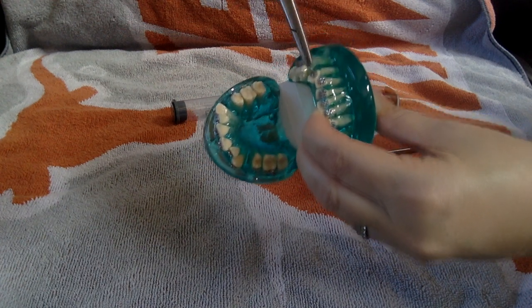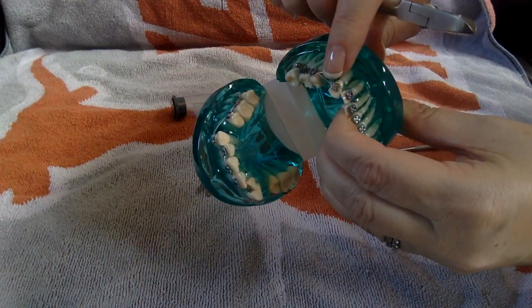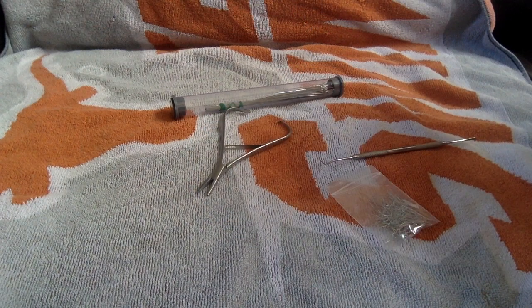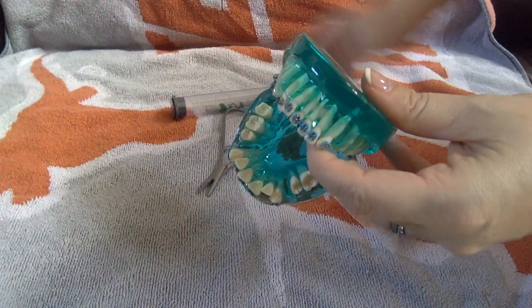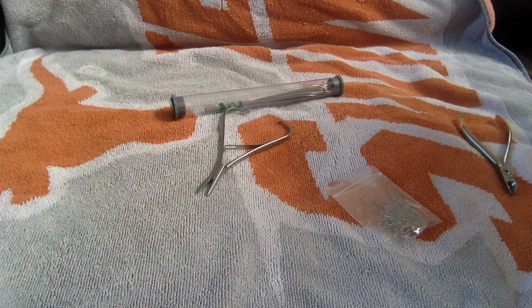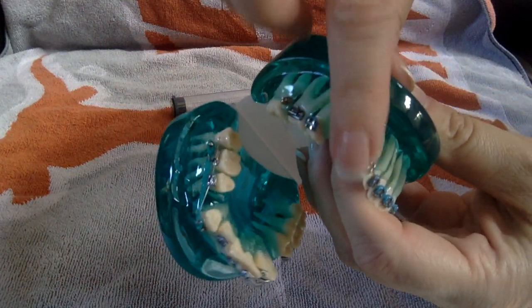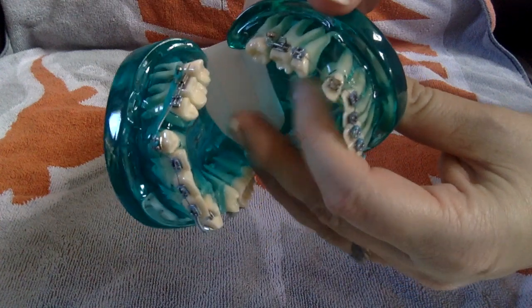Once you start to see it double back on itself, go ahead and stop. Get your pin cutter and cut it with a little flash at the end — don't cut it flush, otherwise it's going to unravel. Leave a little flash and then tuck it under the wire. This is where the ligature director is really great. Always instruct the patient that if it comes out or becomes pokey, to use a pencil eraser to tuck it back under — that's the safest way, they can't really mess anything up. It's not sharp now. Use your nail or ligature director to push it down. That's how you use a ligature tie — a shorty.